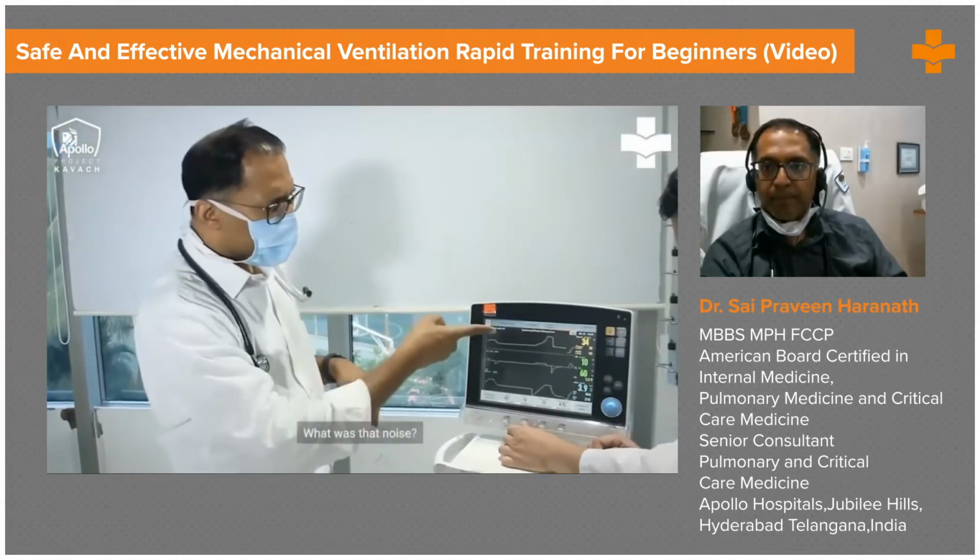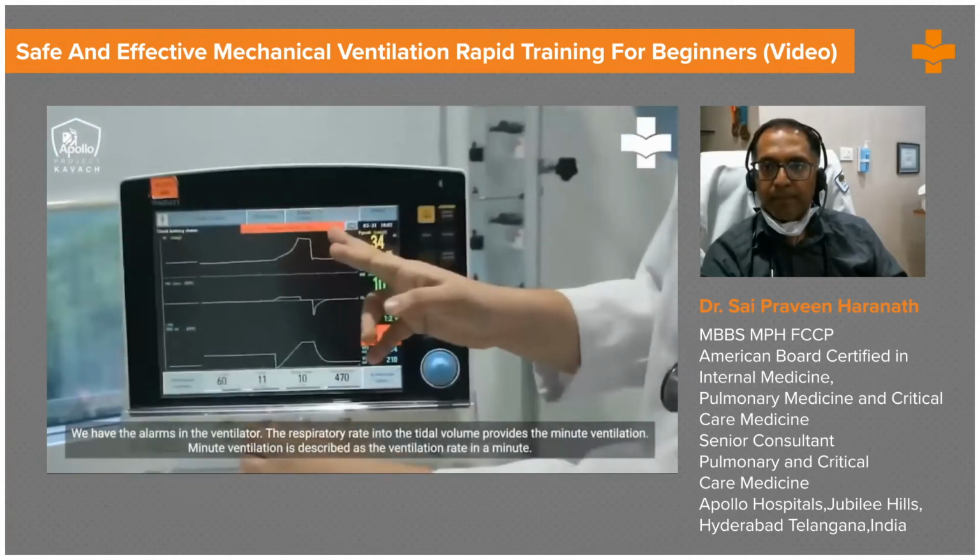What was that noise? Can you tell me what the noise was? We have the alarms here.